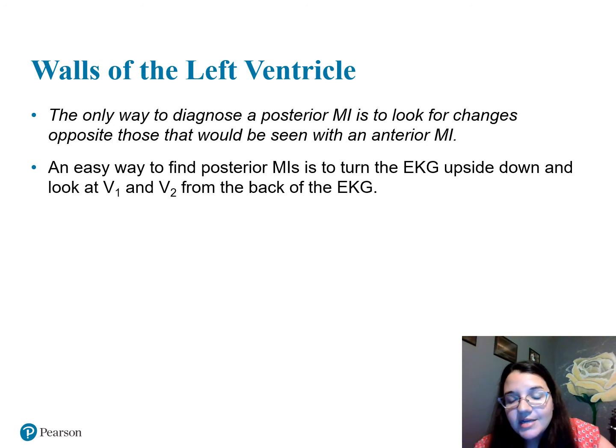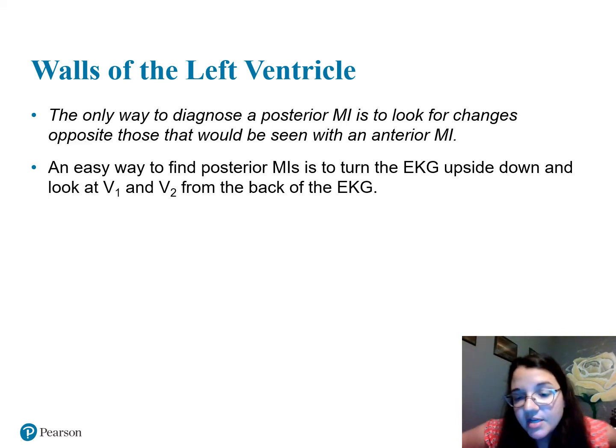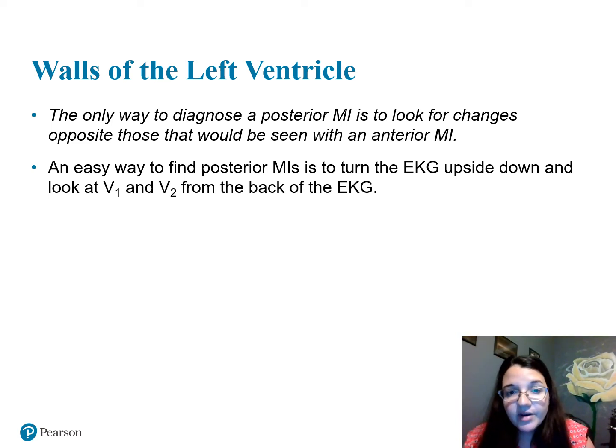But posterior is opposite. So anterior is in front, posterior is behind. So if I'm looking through another lead, it's going to be backwards on the other side. So posterior V1 and V2, I'll look at the EKG upright to see if I have a heart attack. Posterior, I'm going to turn it upside down. And I think I just said that wrong. So anterior, keep your EKG rhythm printout upright. Posterior, you're going to turn it upside down to see if there is a heart attack posterior.